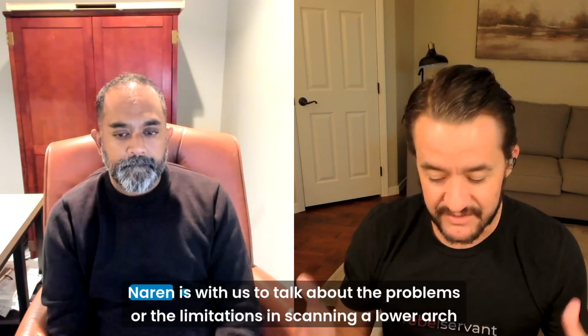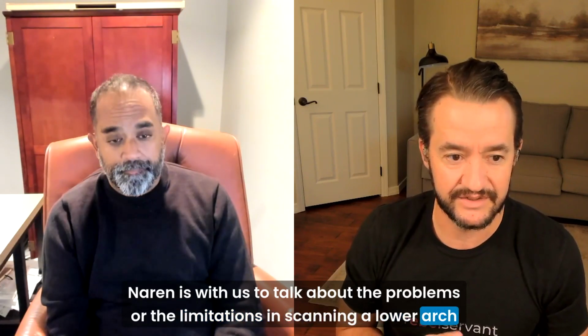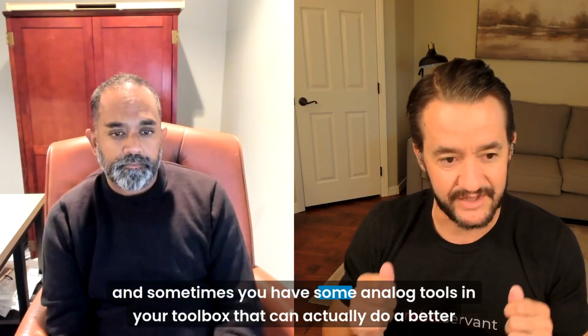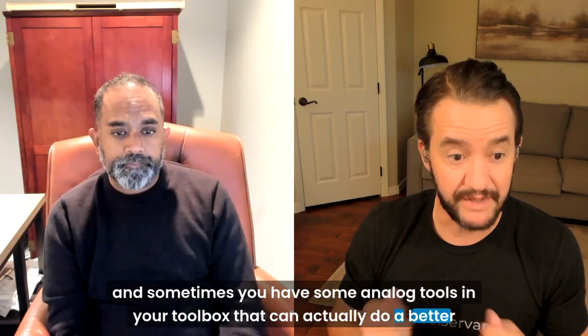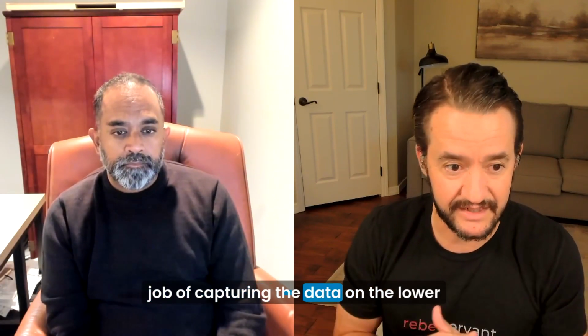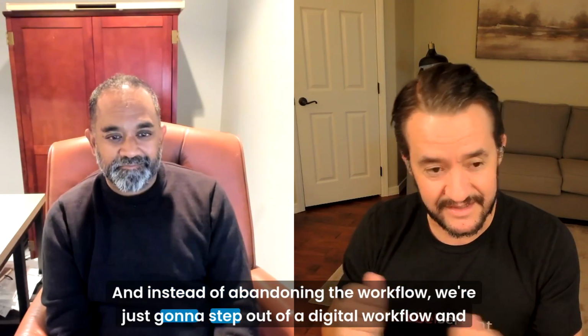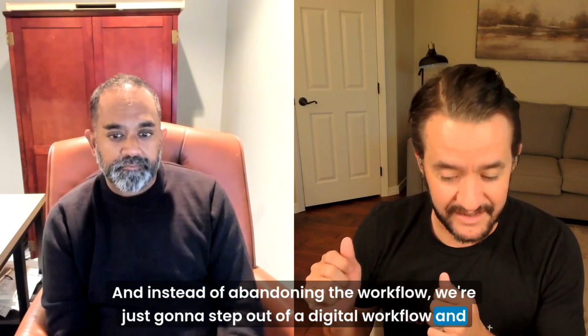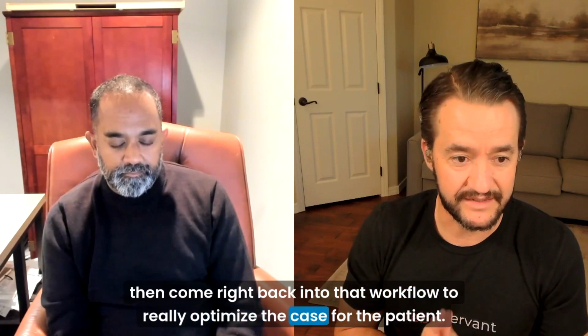So Dr. Naren is with us to talk about the problems or the limitations in scanning a lower arch, and sometimes you have some analog tools in your toolbox that can actually do a better job of capturing the data on the lower. And instead of abandoning the workflow, we're just going to step out of a digital workflow and then come right back into that workflow to really optimize the case for the patient.